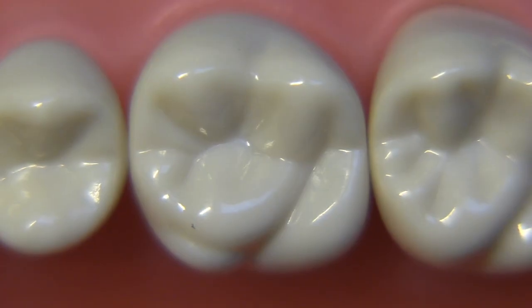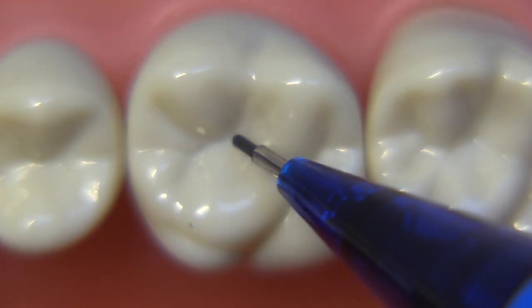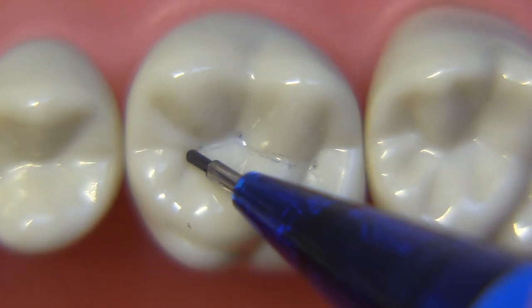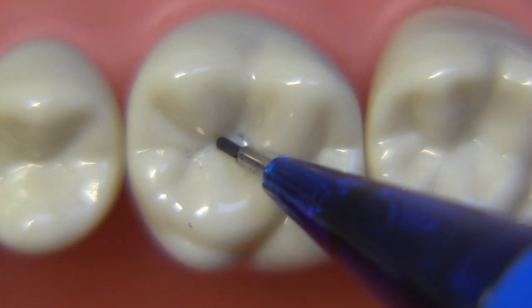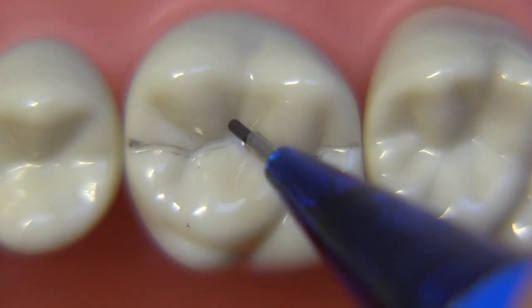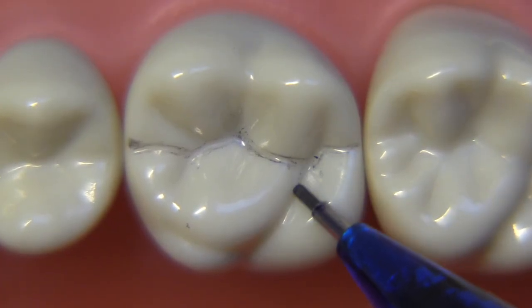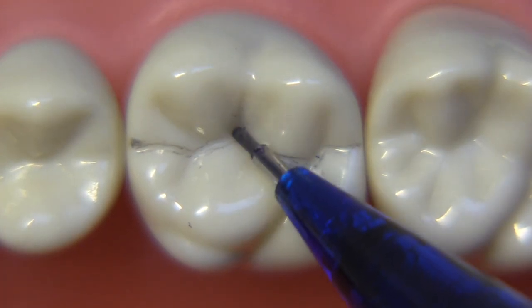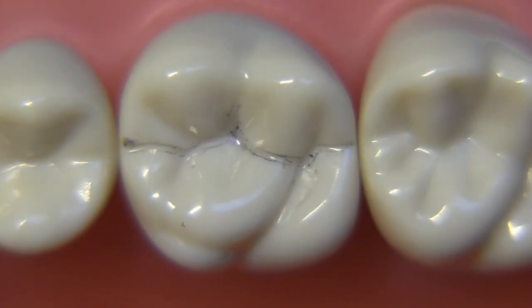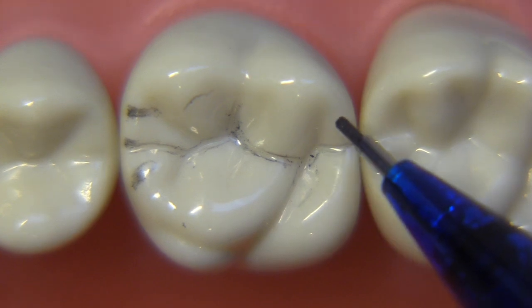Let's get into this particular preparation by starting with some pre-prep planning. We're going to use the Columbia typodont for this particular preparation. It's important to identify the locations of the mesial, central, and distal pits and draw a little line across them so you can get an idea of what the outline form is going to look like. We want to decide ahead of time where you're going to put your bur.